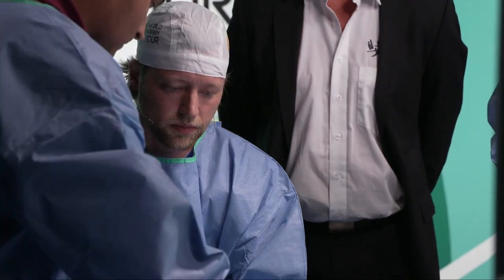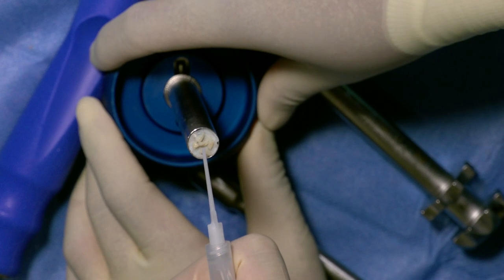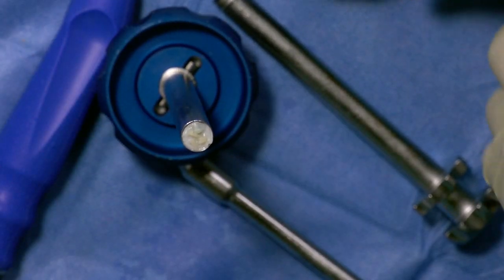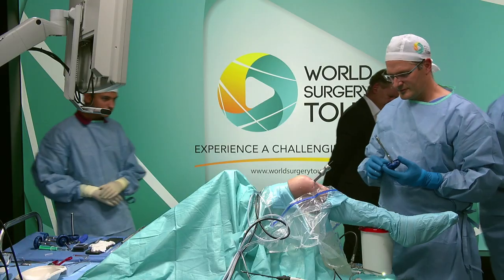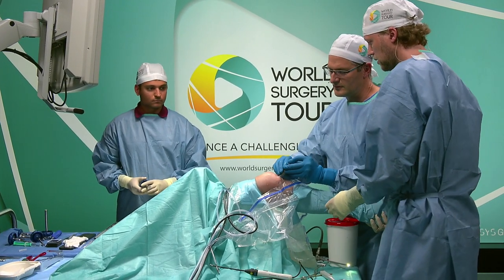Okay, can you hold it, please? Put some fibrin glue on it, not too much. Oops, okay, here we go. And let it sit for a second while we use a microperforator to prepare. So may I give it to you? Scope. So okay, hold it.